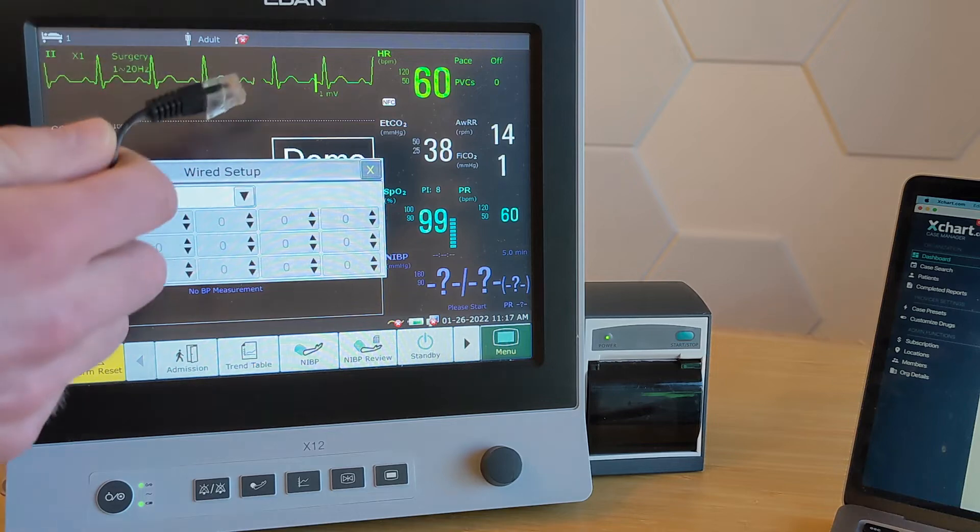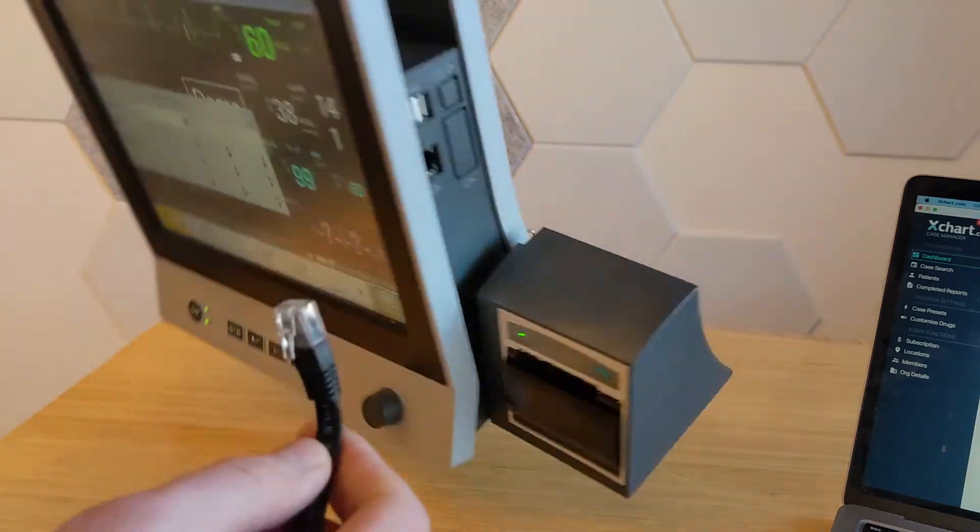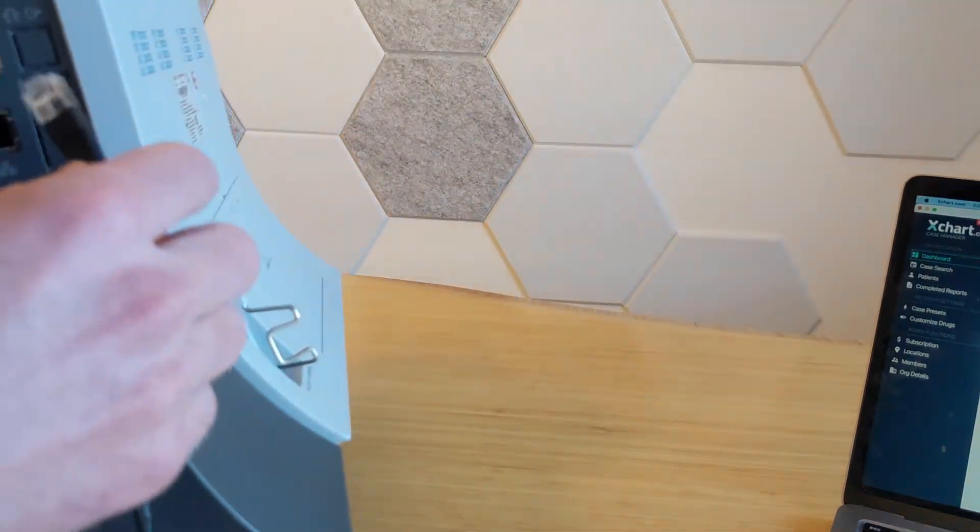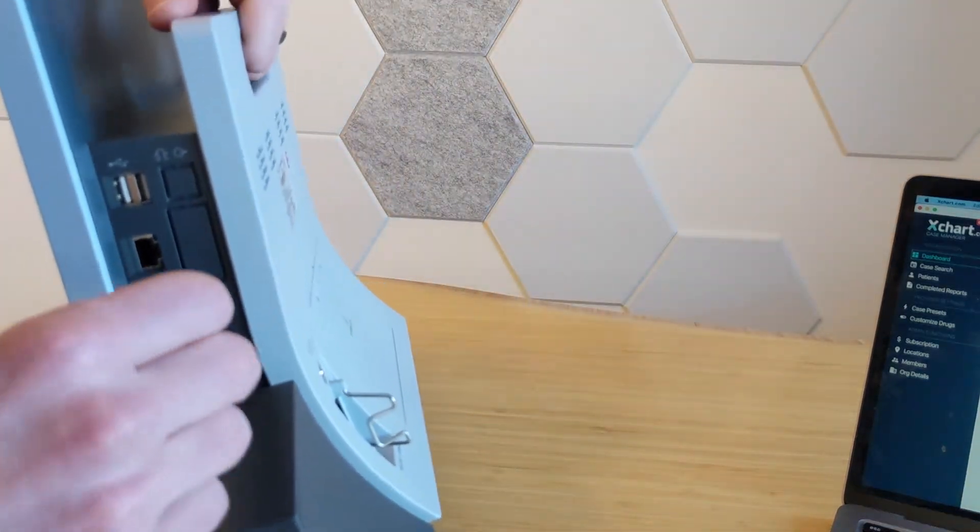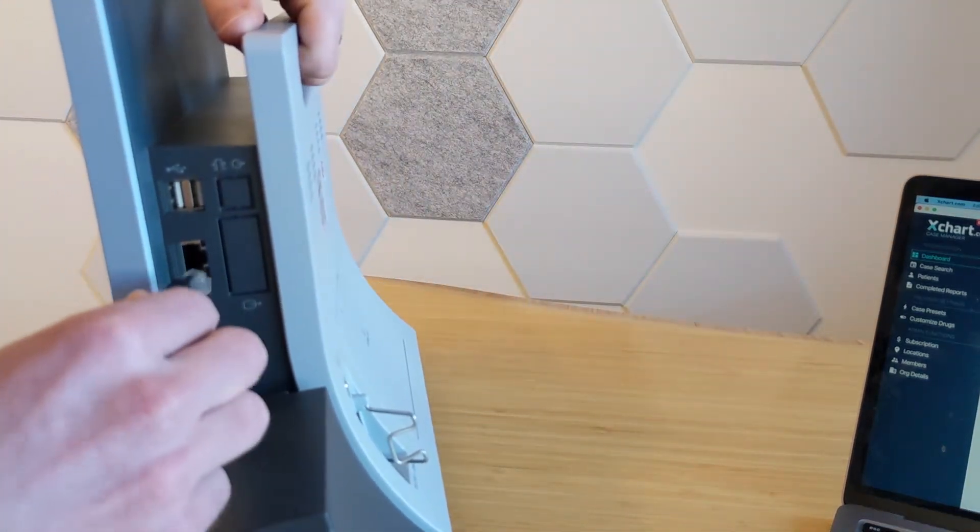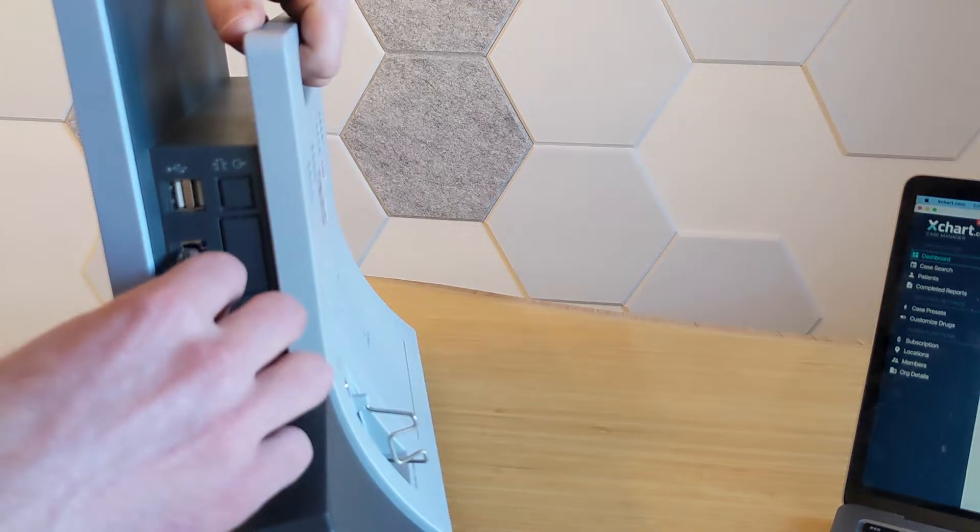And then we're going to want to plug it in. So we've got a network connection here. And just turn it to the side here. There's a network port. You want to plug that in.